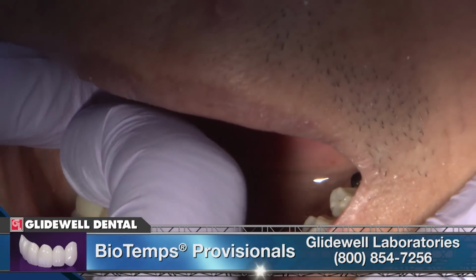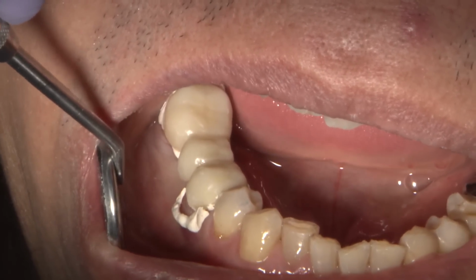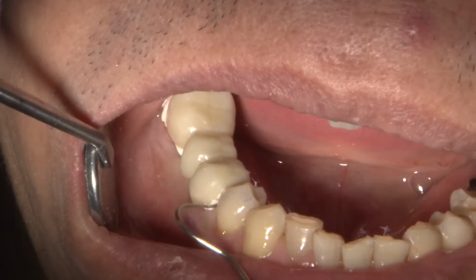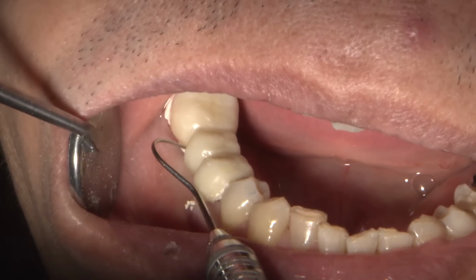I didn't like the design of the pontic being shaped as a bicuspid. Since the elimination of the undercut provided more space mesiodistally, I requested a design modification in the final prosthesis. So to restore the function and provide better aesthetics, I requested the pontic to be shaped as a molar over the edentulous area of number 30.